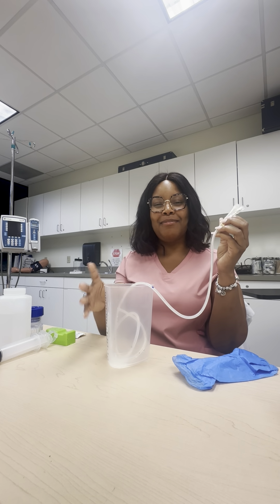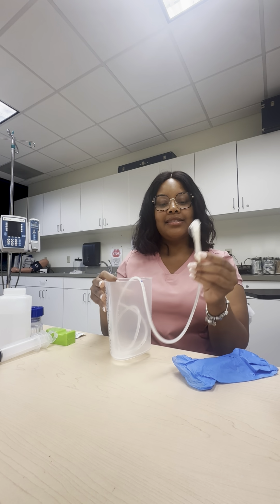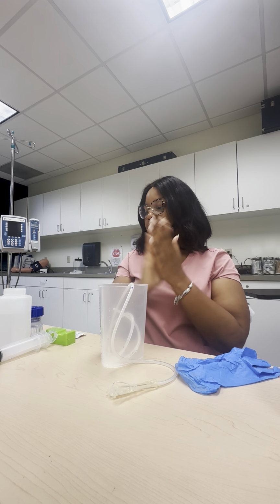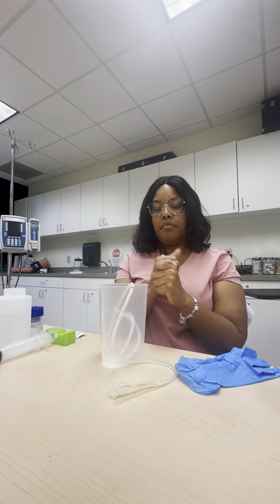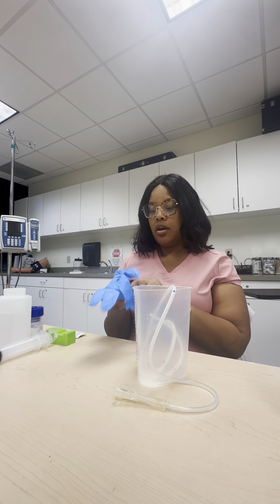So this is going to be our stomach right here. So this is going to be our PEG tube right here, and this is our stomach. All right, so we're going to go ahead and perform hand hygiene. And we're going to put on our gloves. All right.